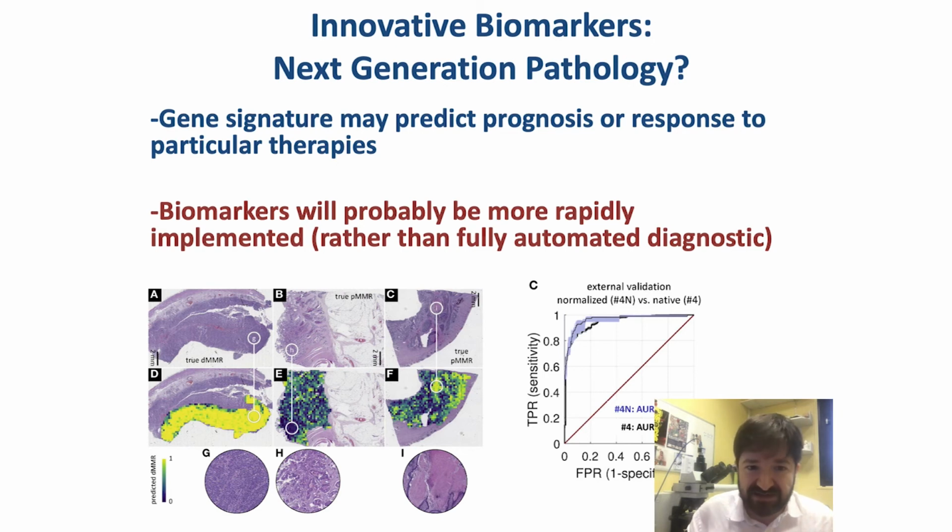You know, it's very expensive. It takes a long time. So now, in just a few minutes, by processing the digital slide, you can predict this particular phenotype. And so it could really reduce the cost of screening, allow screening of more patients more rapidly, and avoid misclassification.